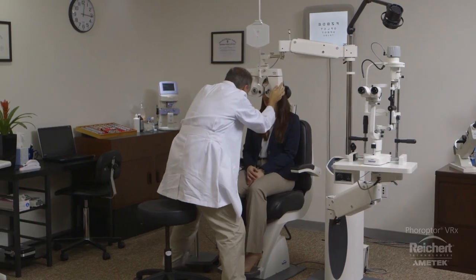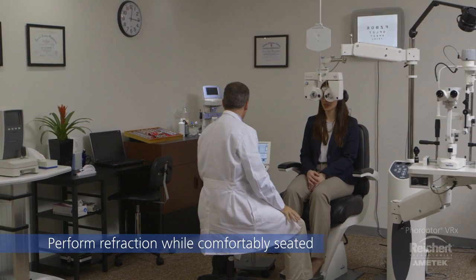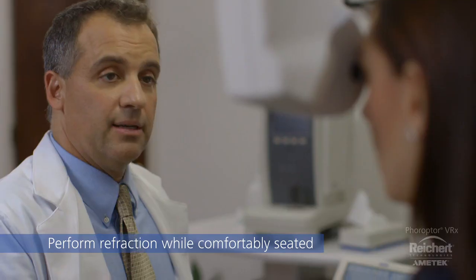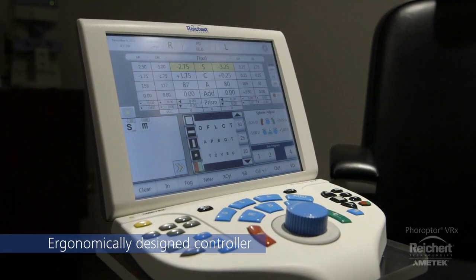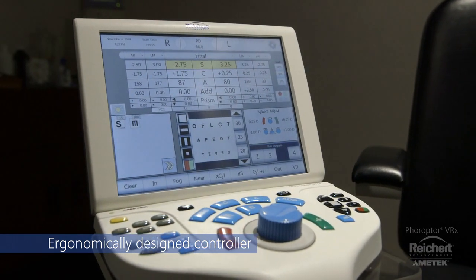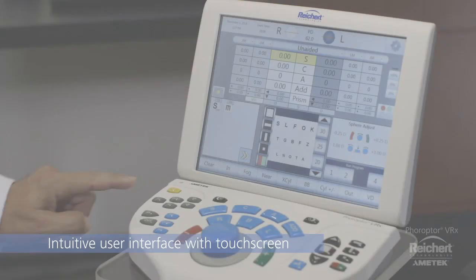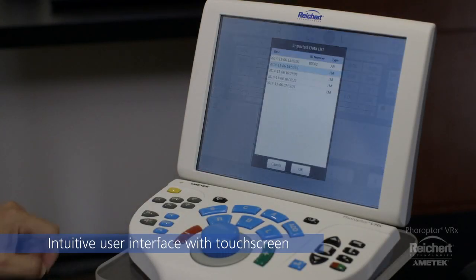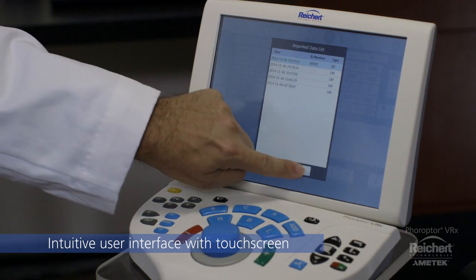Feropter VRX easily adapts to your practice, allowing you to rapidly perform all of the functions of a manual feropter and so much more while comfortably seated next to your patient. Featuring a logically and ergonomically arranged keypad and multi-function knob, the controller is designed to enhance the user experience. You can also access all functions and settings of the intuitive user interface through the integrated 10.4 inch tilting touchscreen.